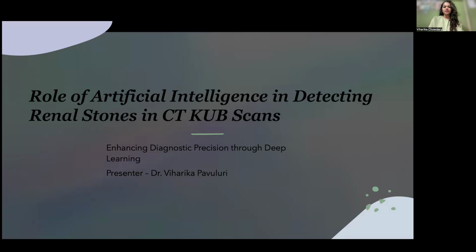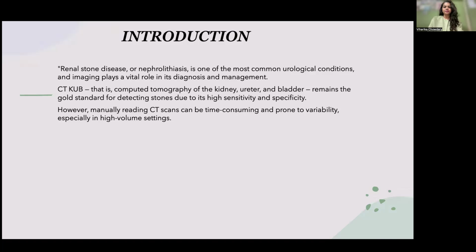Thank you so much for joining for this short presentation on research titled Role of Artificial Intelligence in Detecting Renal Stones in CT KUB Scans. This is published in IJSR. We'll go to the introduction.